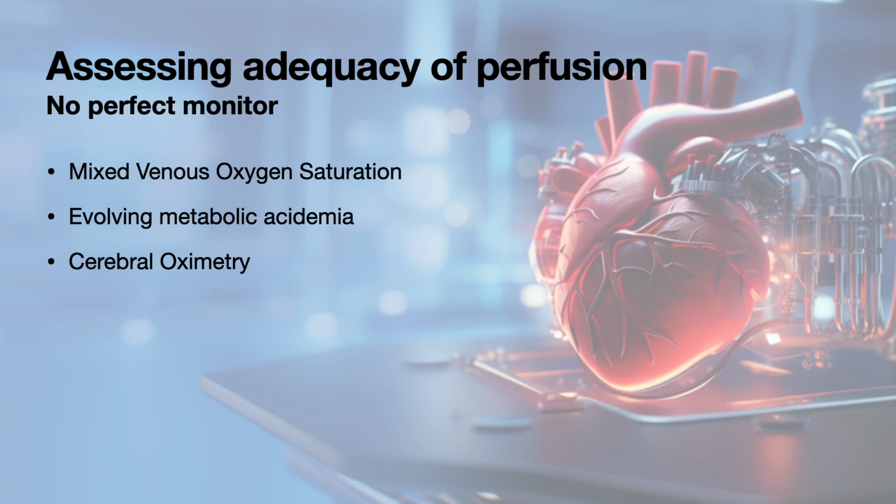So under cardiopulmonary bypass, will the brain be a leading or lagging indicator of the adequacy of global oxygen delivery? This is an unresolved question. A raw or processed EEG, which begins to show an inappropriate slowing or burst suppression, which is not commensurate with the effects of medication or temperature, could be a sign that the brain is not being adequately supplied with oxygenated blood.